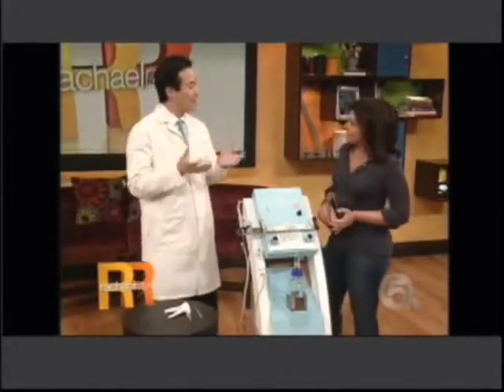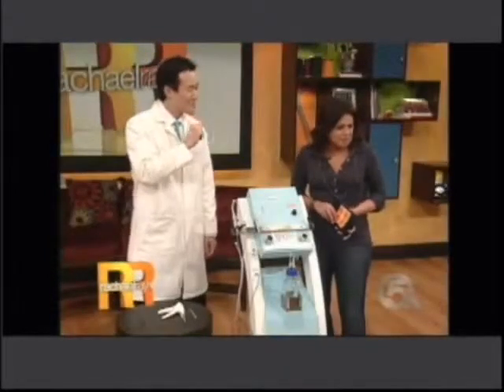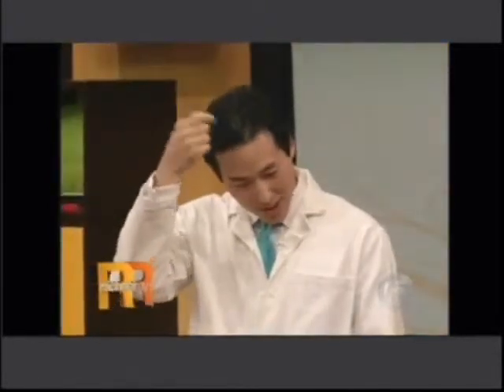The third step is we have a team of assistants that literally take that strip of hair and whittle it down, okay, into each individual hair follicle, thousands of hair follicles. So it's a team of assistants, and it's very tedious. What does that job pay, huh? The fourth step is I take a big needle, and we take a look at the bald part that we're doing, and literally poke thousands of little holes into the bald area. And the last step is take each individual hair follicle, grab a tweezer like this, and plant it into each little hole. And that's hair transplant surgery.